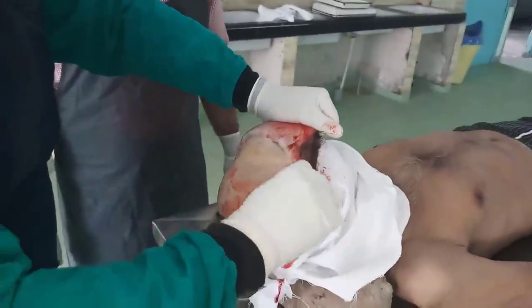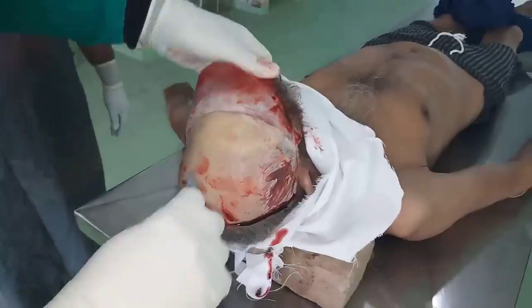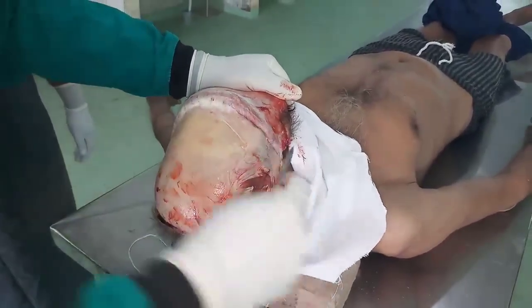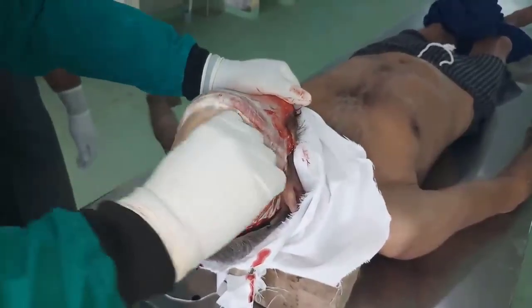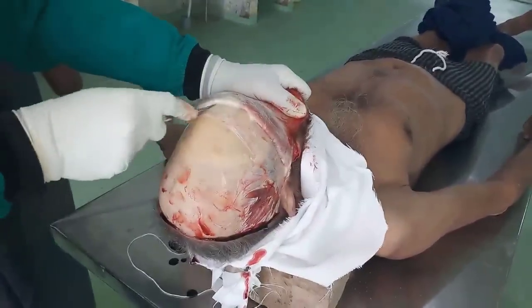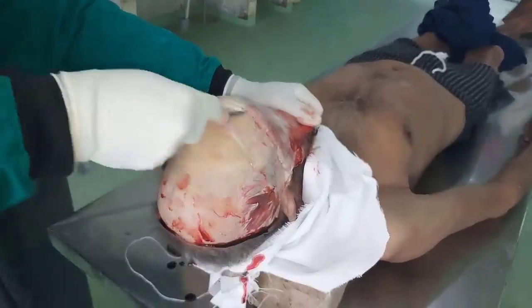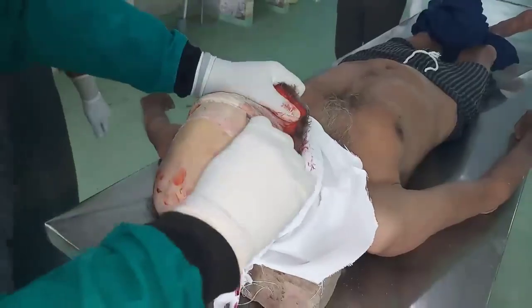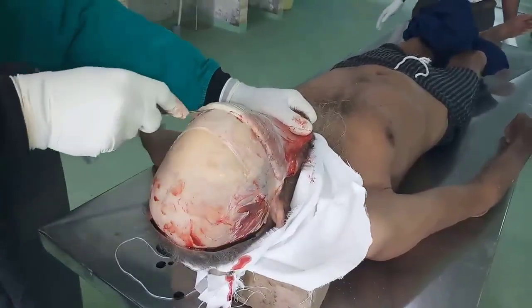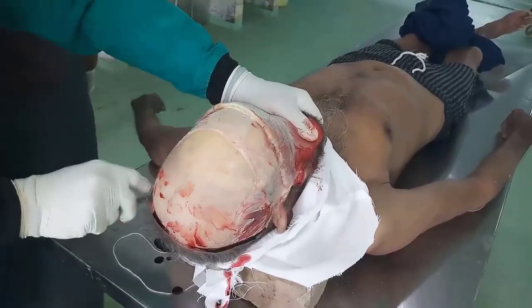So the anterior flap we are retracting forward, till the supraorbital margin. So, like this.